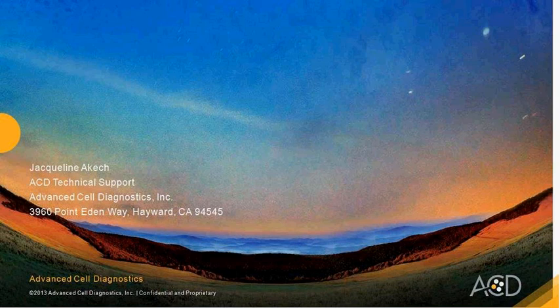If you go back and review the scoring criteria, you'll notice that the dots can appear as independent single dots or as clusters. So if you're seeing positive signal and your background is clean, then that's real signal, and it's basically a factor of the number of copies that you have per cell. So the higher the number of copies, the more the dots would cluster.